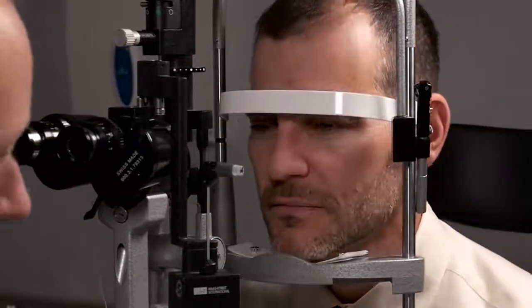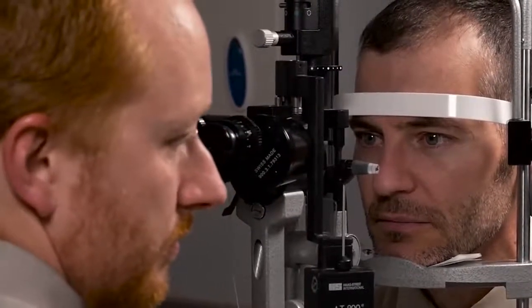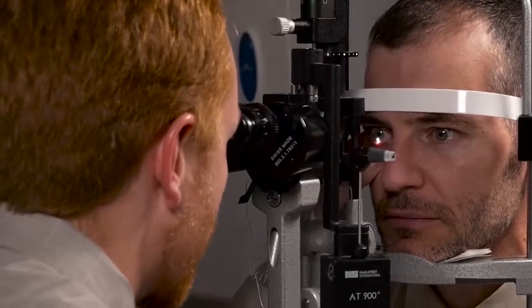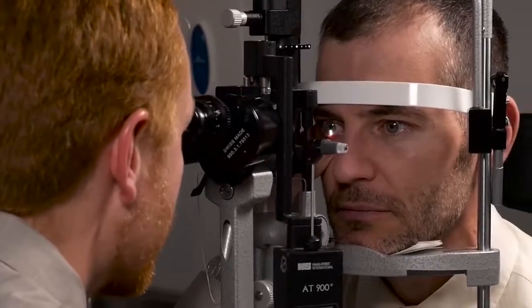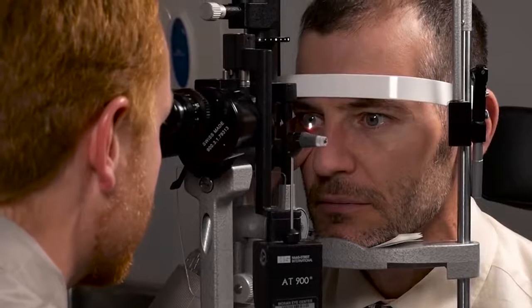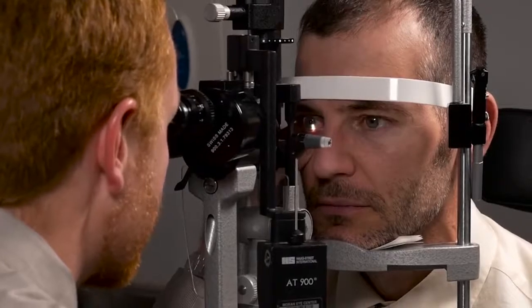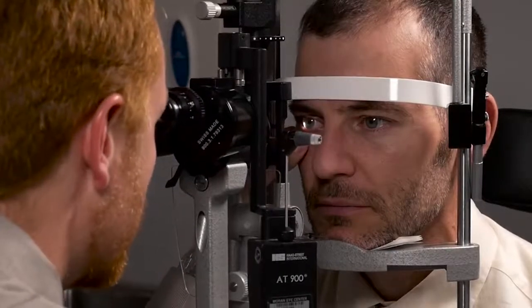We've given the patient a solid five minutes to let the contact lens settle down. Now I'm going to pull the slit lamp over and take a close-up look at the lens to make sure it's fitting properly. Have the patient put your chin down and forehead resting forward. There are several factors when assessing a contact lens. We can pull down on the lower lid gently and see the toric marking. In this particular brand, the toric marking should ideally be at 6 o'clock. The contact lens is about 10 degrees to the left, so it's rotating a little bit temporally. Ideally, you would like the contact lens to move about 0.1 to 0.2 millimeters on a blink, but not too much, as that will be uncomfortable.